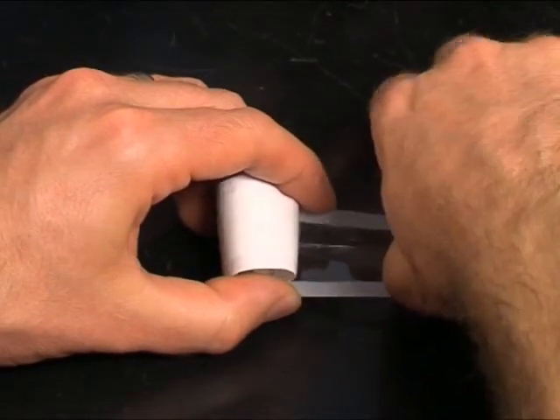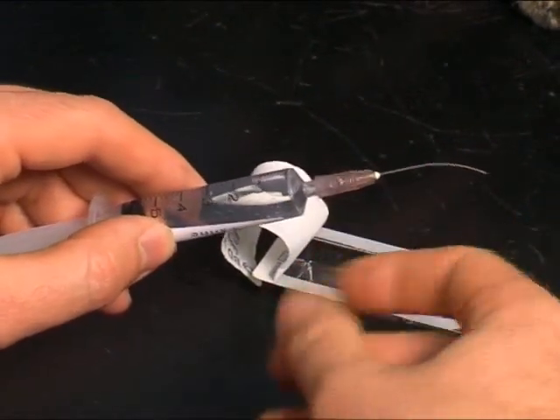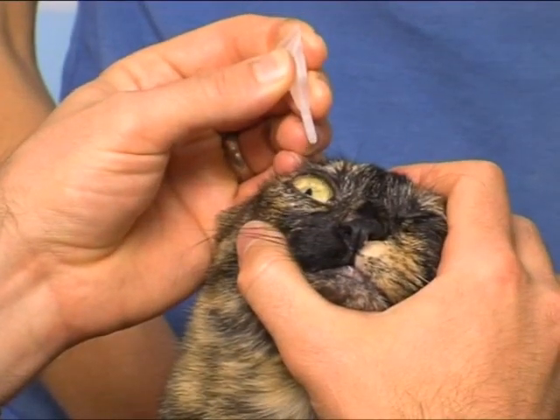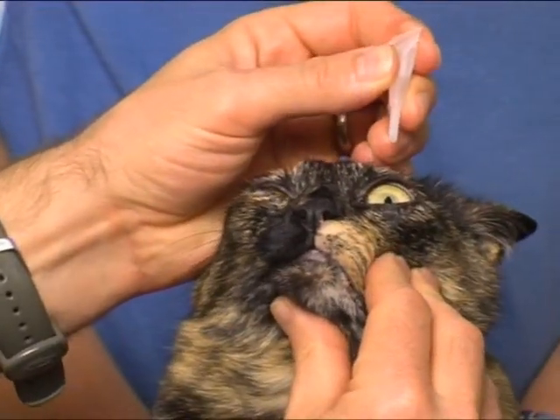Firstly, you need to assess both eyes and drainage on both sides. If there is no fluorescein in either nostril, you must be suspicious that it could be draining into the mouth. You can look under the lips, look inside the mouth, see if there is any fluorescein apparent. The next step to pursue if you're not getting that drainage is to flush the ducts, and this is usually done with saline, and you can often do this under local anaesthetic. It's very rare that you need to anaesthetise an animal fully.